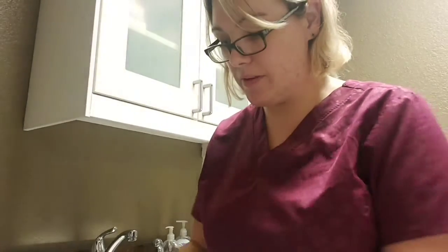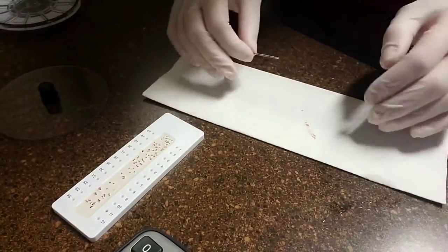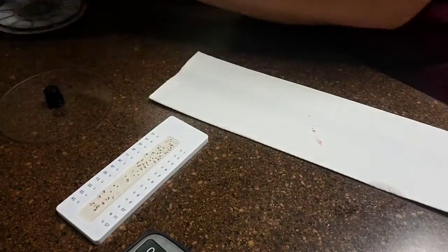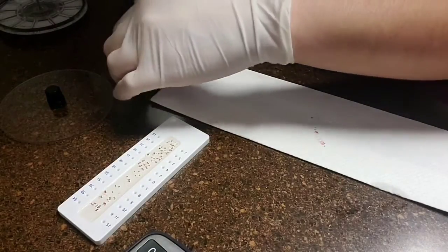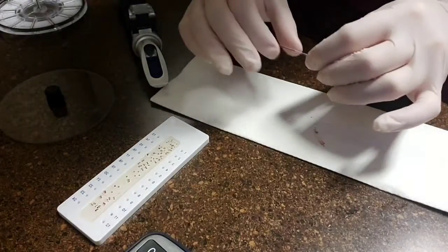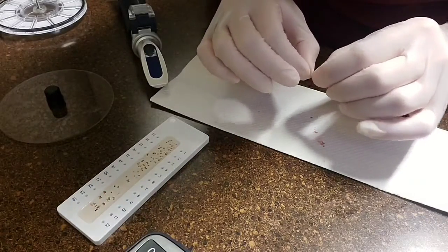Now I'm going to go ahead and work on my other tube here. So I'm going to bring you down here a little bit with me, hopefully. Alright. So all we're going to do is test total solids like we would normally with our PCV total solids. So I'm just going to break this right here.